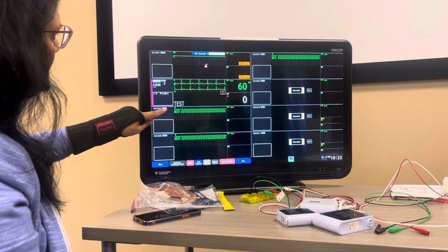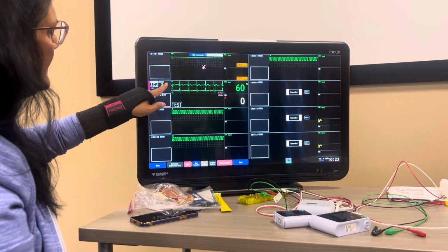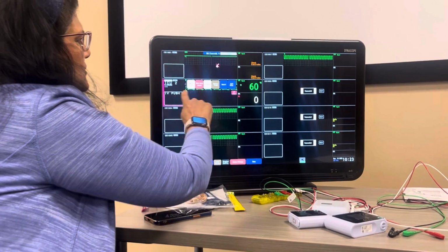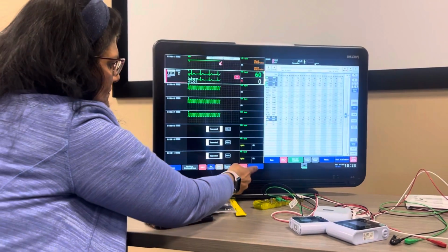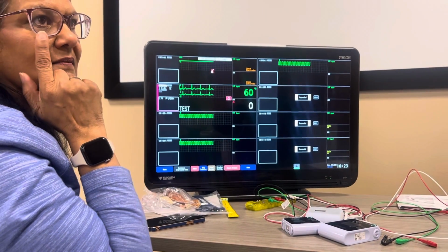Of course, this is your DNR. This is your notepad. And then you see where it's just blank here? If I click on that, I get a little cheat sheet. So let's say I want to go straight to the vital signs. I click it, and it takes me straight there. Like little quick links. I do like that there are multiple ways to do things.